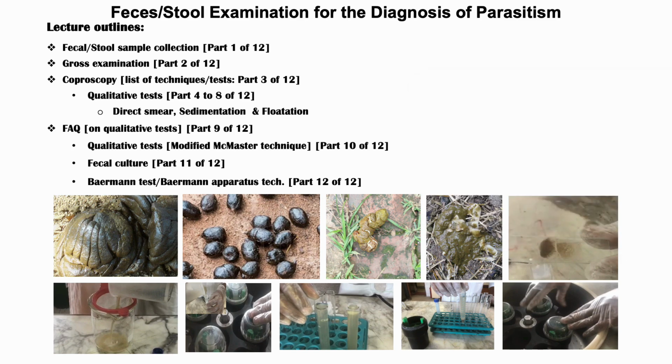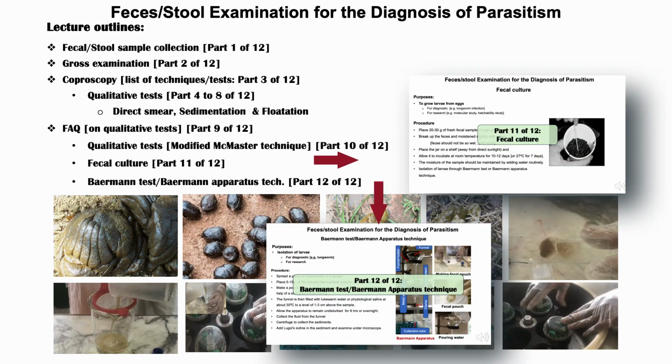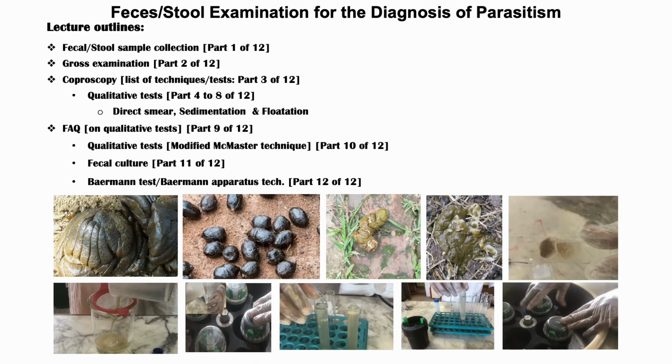Finally, in parts 11 and 12 of this lecture series, fecal culture and Baermann apparatus techniques, or the tests for the isolation and identification of larvae in the diagnosis of parasitism, will be discussed.